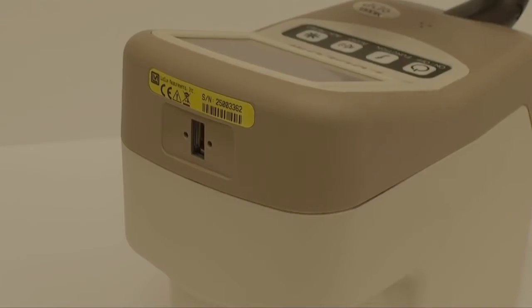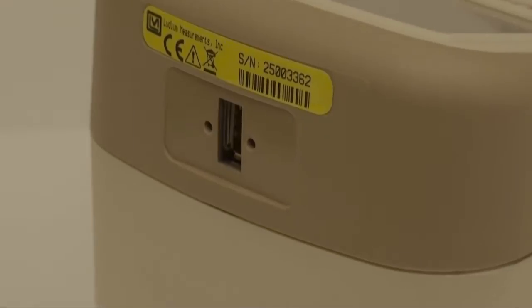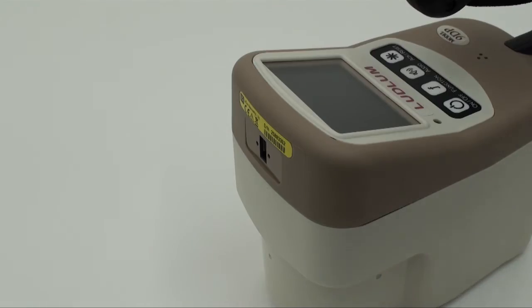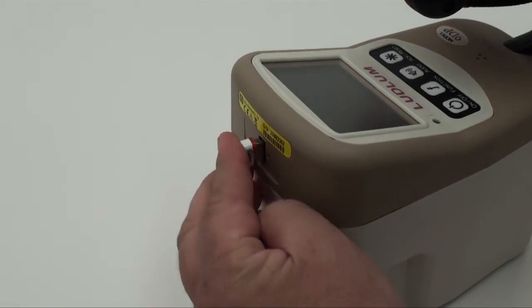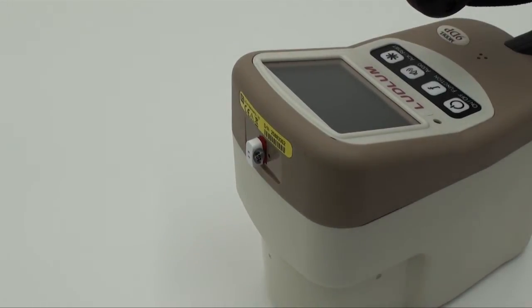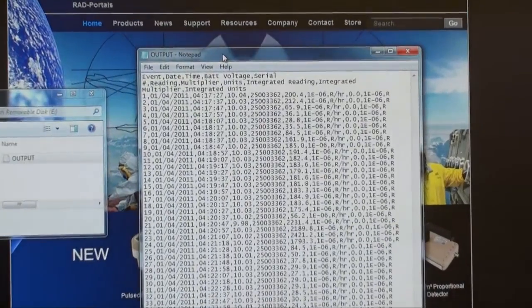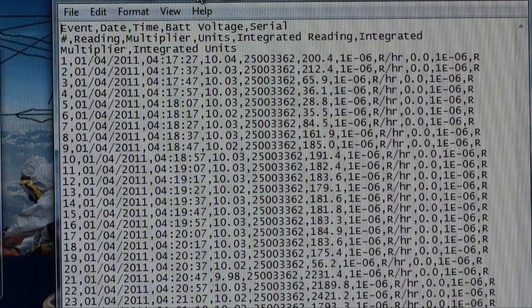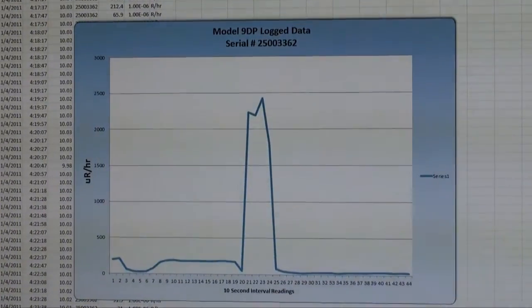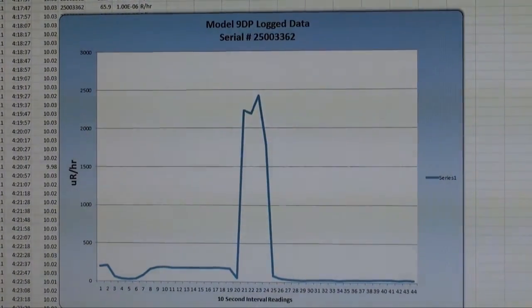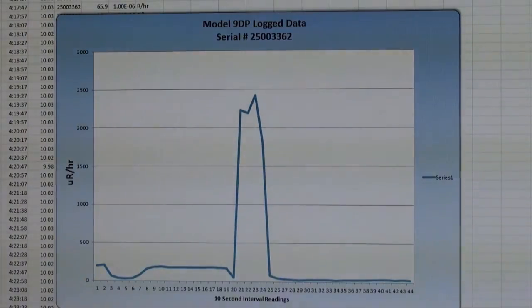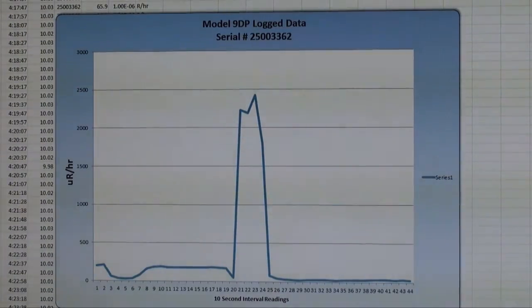A key feature of the model 9DP is a USB port that enables four very valuable benefits in a radiation instrument of this type. The first is data logging, where data is stored to a USB thumb drive inserted into the instrument. Data is written in comma separated value format so it can easily be retrieved by PC spreadsheet and database programs. Logging intervals are programmable with each data point including a real time and date stamp, the radiation rate, the integrated dose, and the instrument status.